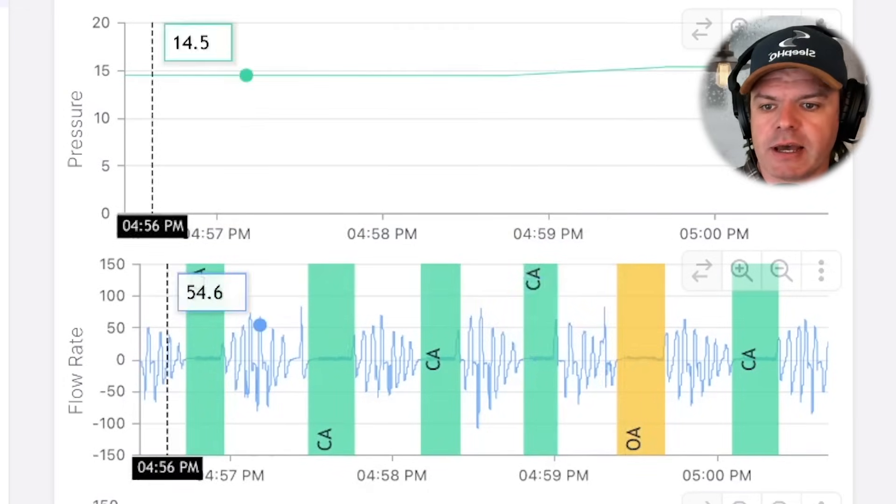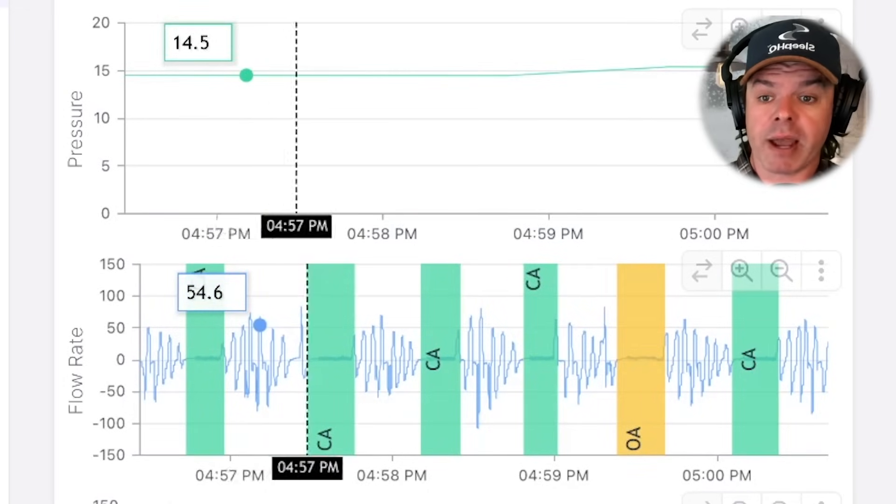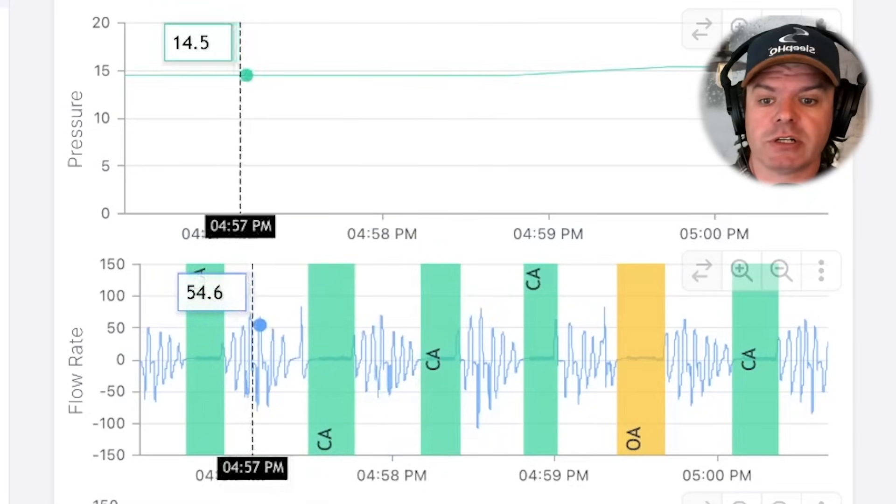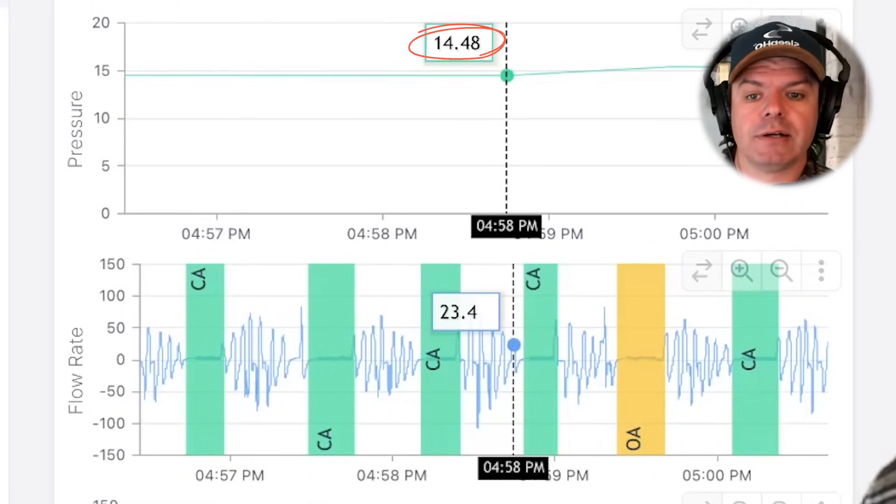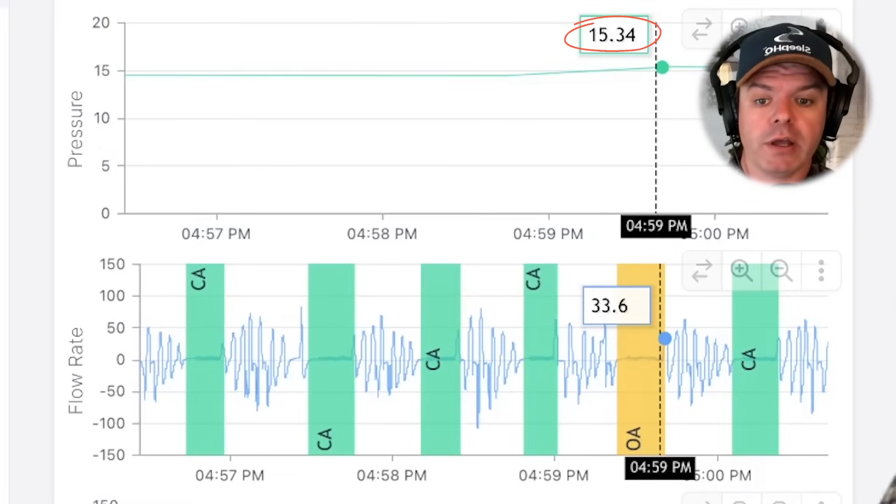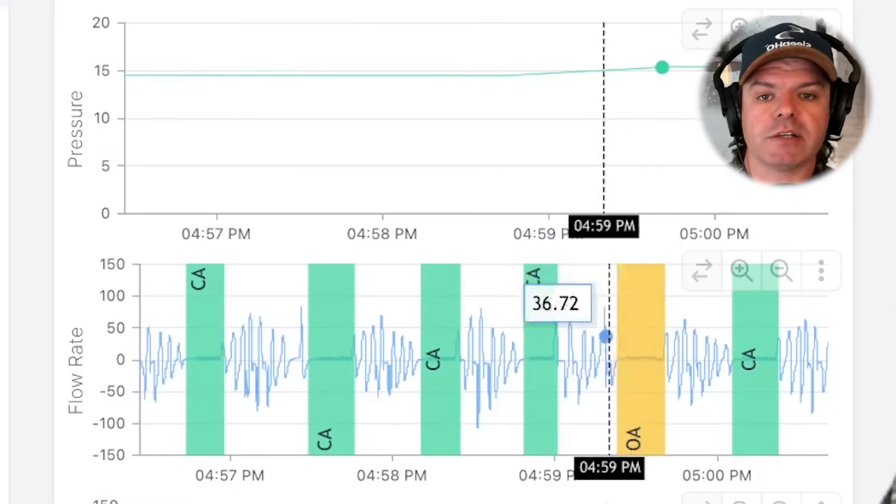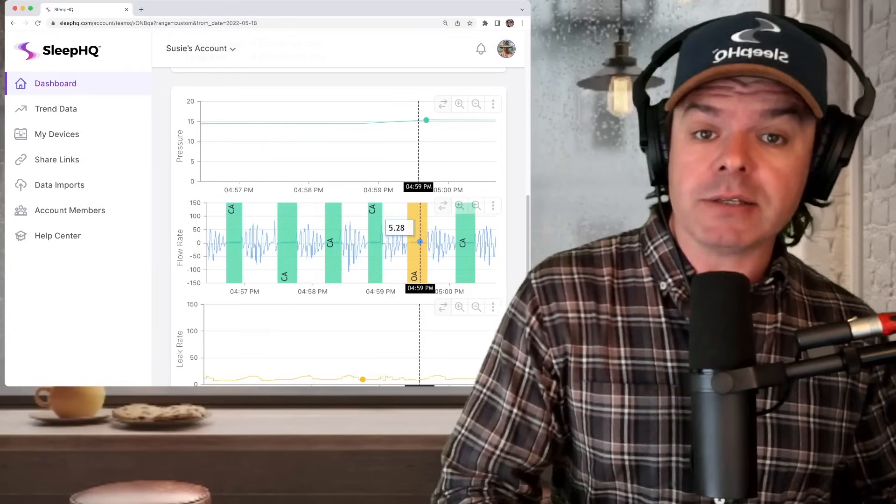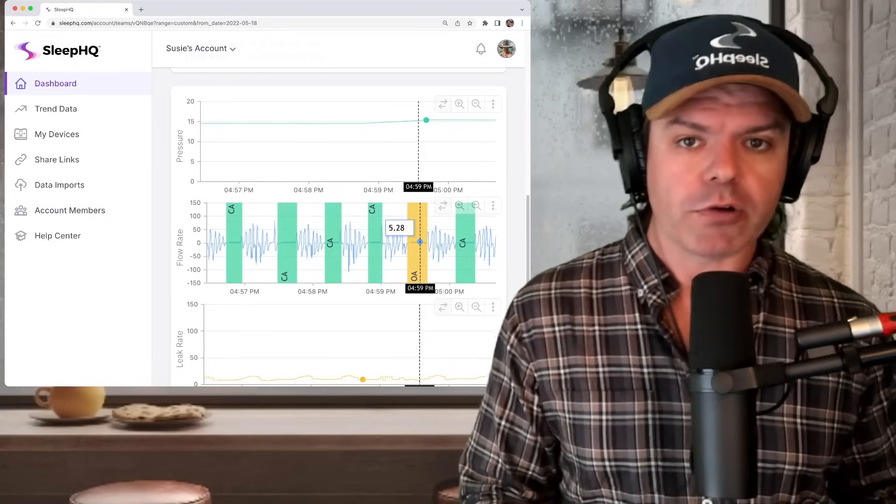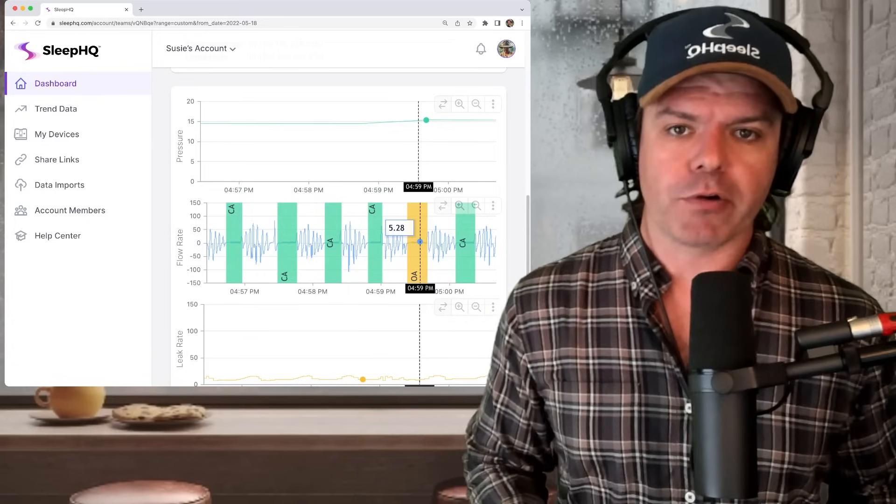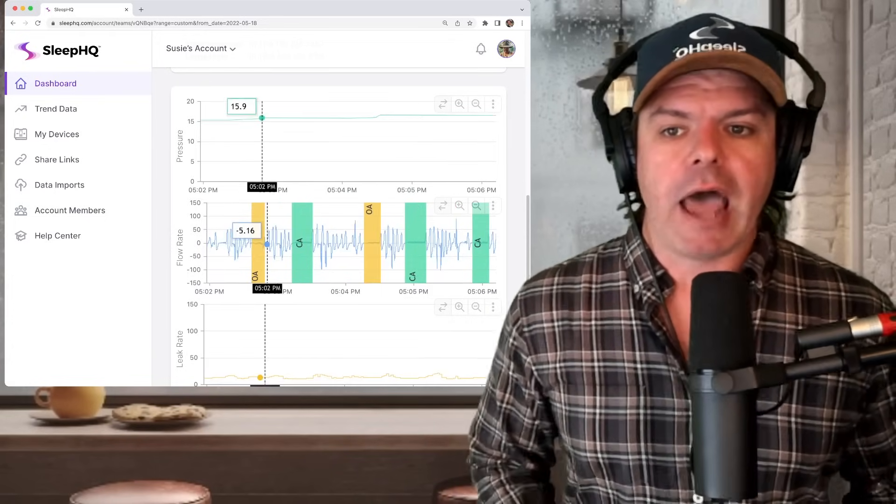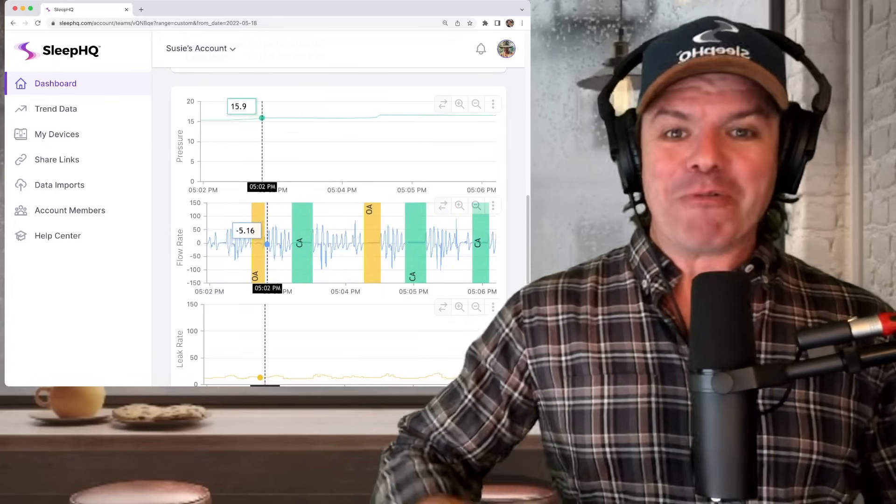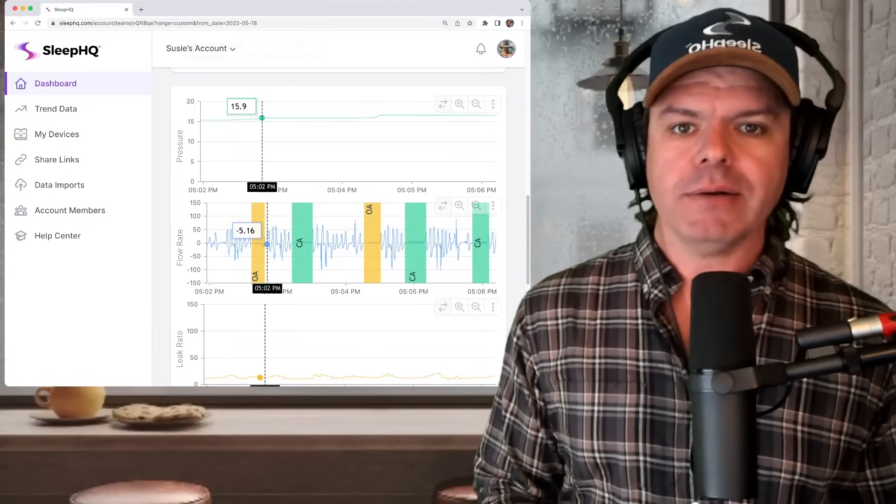And let's have a look what happened with the pressure. So you can see here, with the clear airway events, the pressure is remaining very stable, it's not moving much. And then all of a sudden, it jumps from 14.48 up to 15.34 in response to this apnea event. Because as we know, with obstructive apneas, how do we treat them? We increase the pressure. But it was a false flag. It shouldn't have been increasing the pressure. It's really a clear airway event.